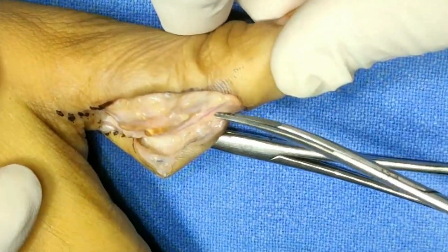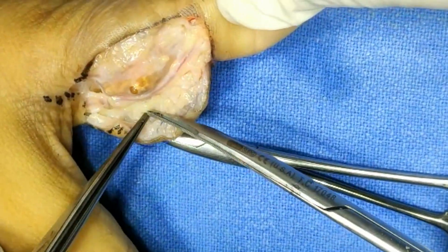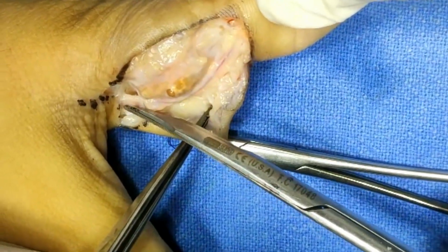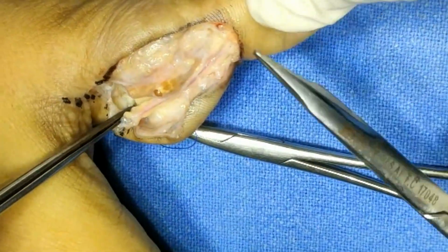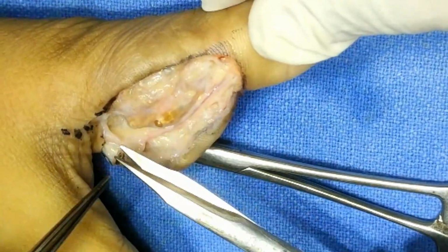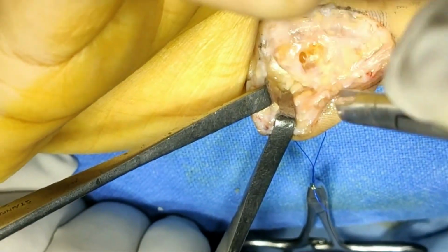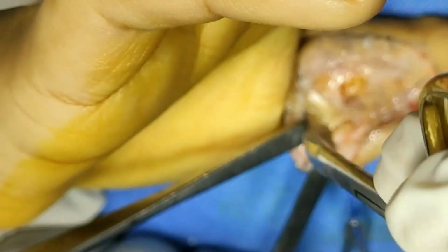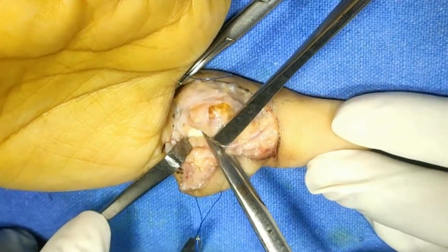Nerve here, nerve rotated. Now you can notice, the trick behind removal is you explore the neurovascular bundle proximally and distally, and now here the tumor is coming out from the flexor sheath, that I will show you here. This is the tendon sheath here.